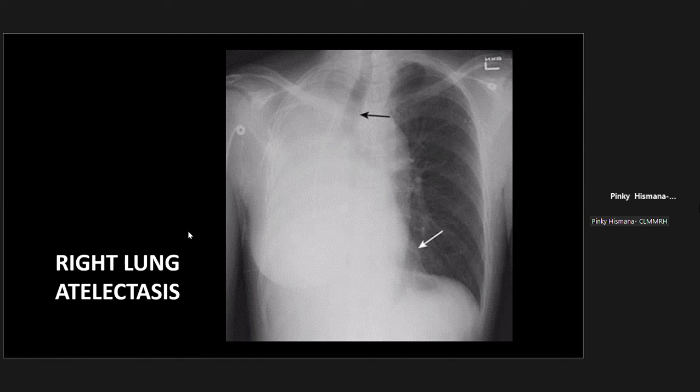Nicole Alejandro, what do you think actually is, can you point out any problem with this image, Nicole? Good evening, Doc. If you notice, Nicole, the white arrow is pointing at something. What do you think is the problem there?